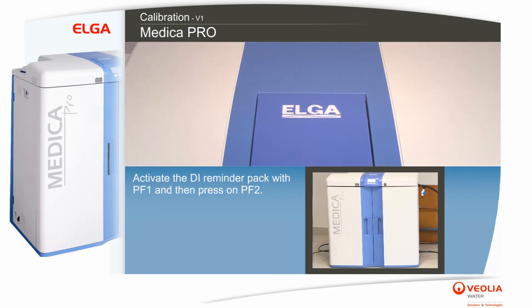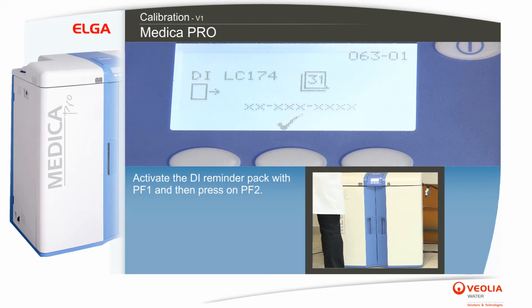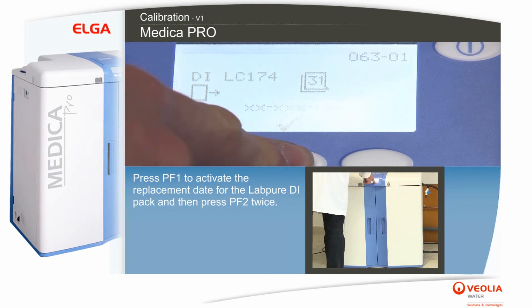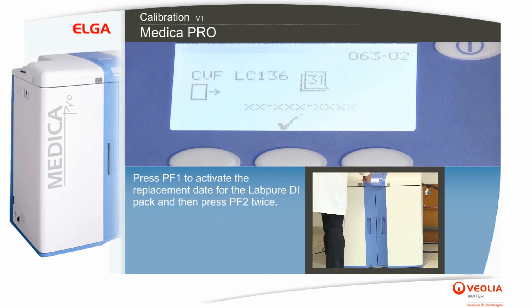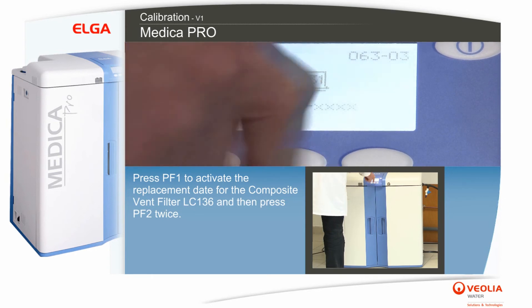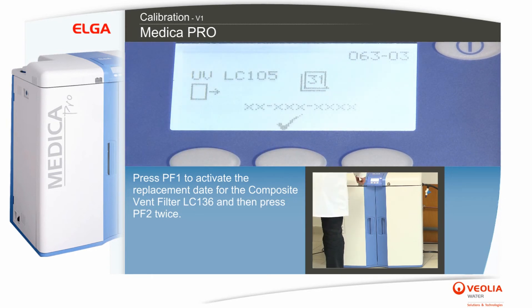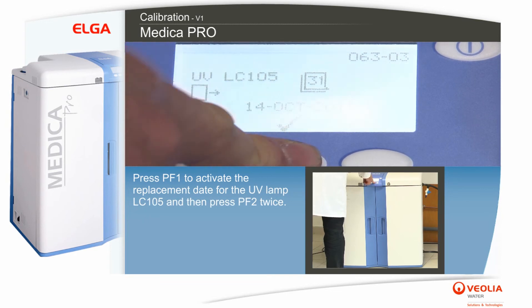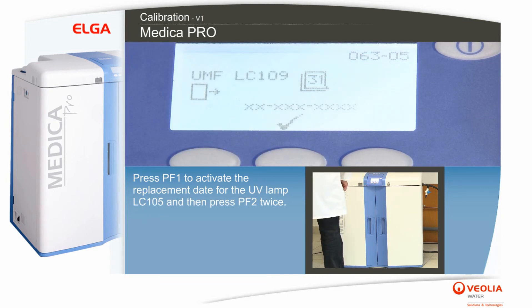Activate the DI reminder pack with PF1 and then press PF2. Press PF1 to activate the replacement date for the LabPure DI pack and then press PF2 twice. Press PF1 to activate the replacement date for the composite vent filter LC136 and then press PF2 twice.